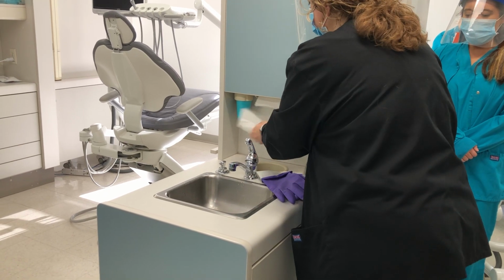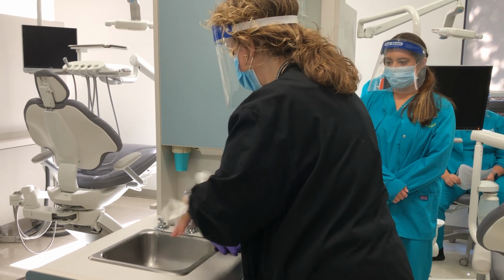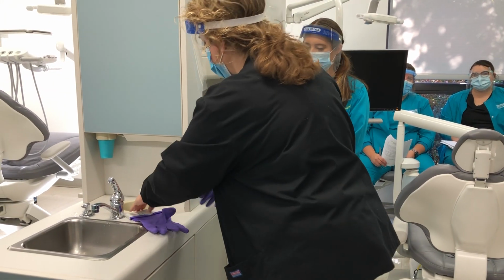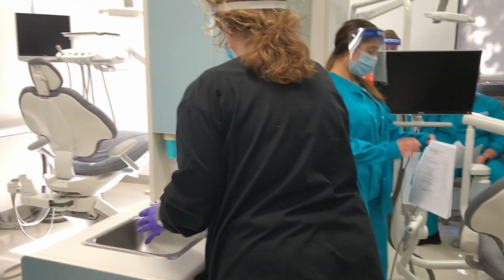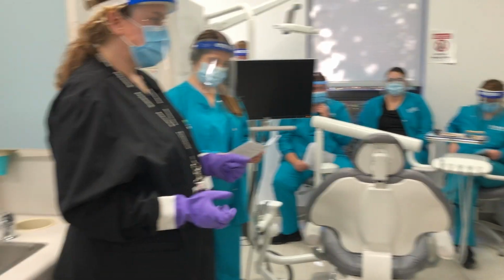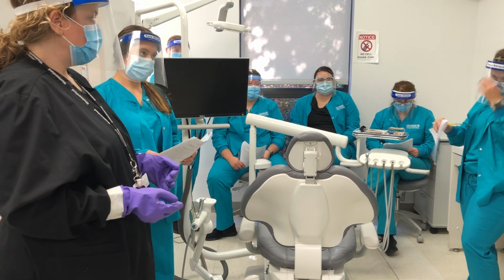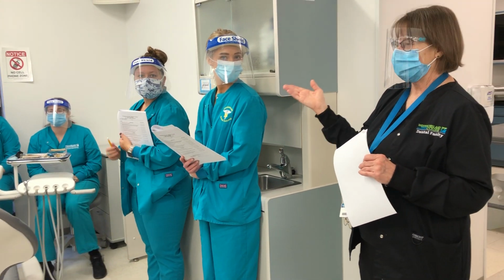Okay, and dry your hands really well. And then we're going to be using our utility gloves. So that is, I believe, number one, because it has don the appropriate PPE, and it tells you that you have utility gloves, masks, and goggles. For us now, we have the face shield, so you may or may not have the goggles with it. When you're at pit, you're gonna have those, and you may also have your scrub cap on.